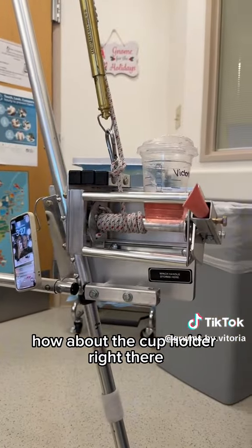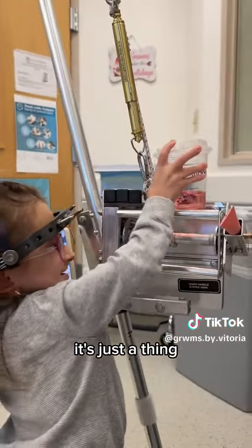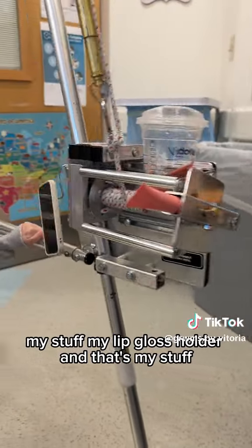That thing that looks like a cup holder right there — it's not actually a cup holder, it's just a thing. I put my device there, my stuff, my lip gloss holder — that's my stuff.